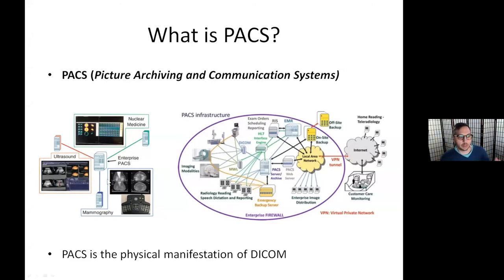I've got two images over here. On the left is a mini PACS. We've got different departments with different imaging technology, like nuclear medicine, ultrasound, mammography, and then they're all going into the enterprise PACS, which is like the server, which holds all the data. PACS is a little bit more than that. It's all these network connections, all these modalities, and also all those servers.